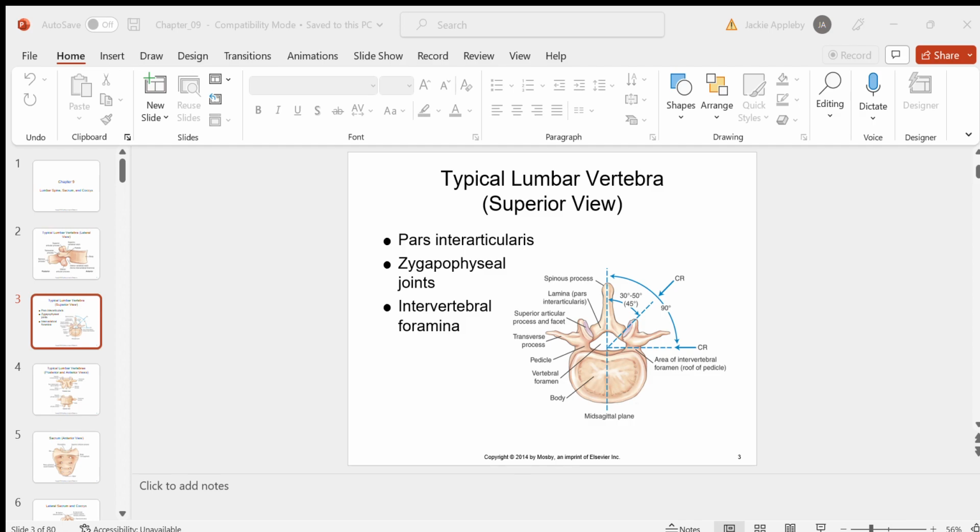This is our main plane of the body. We should get most familiar with the mid-sagittal plane, the plane right down the middle of the body, dividing the body into an equal left and right. And intervertebral foramina, or the notches that make them, lie at 90 degrees to the mid-sagittal plane. So they're only seen when you put the patient in the lateral projection, as I said a minute ago.